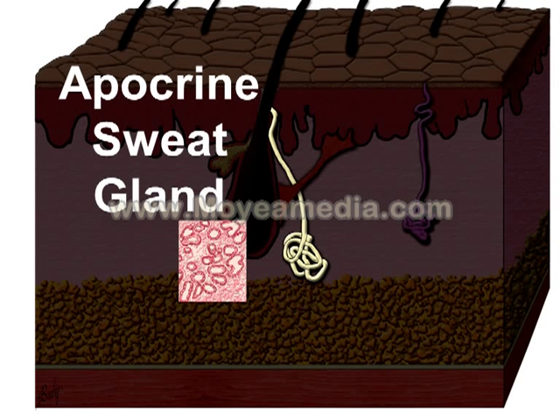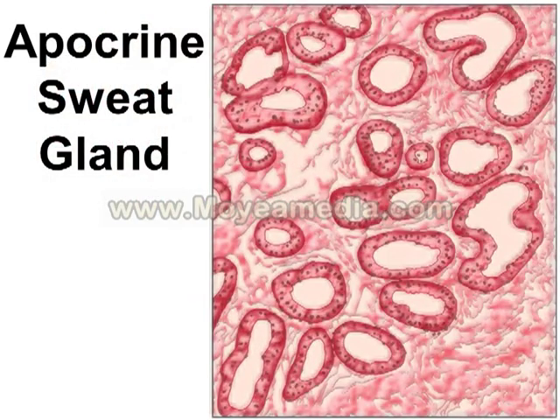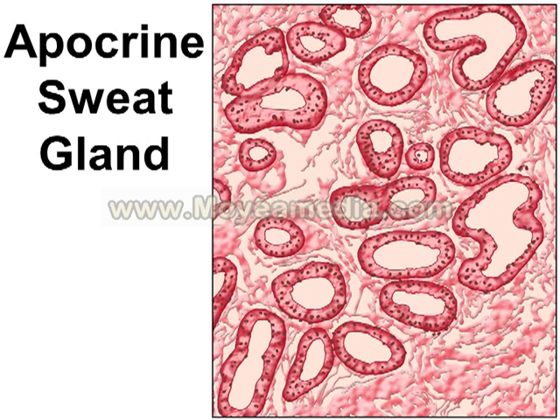The apocrine sweat gland is associated with the pilosebaceous unit. Apocrine sweat is more visible and is fairly brightly eosinophilic, often noted within the lumens, not seen on this particular schematic. When not visible, it looks like this schematic where you have very large soap bubble-like lumens.